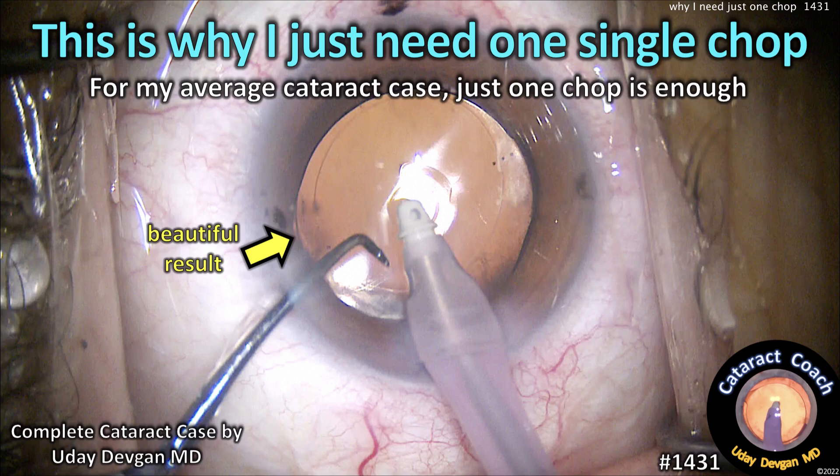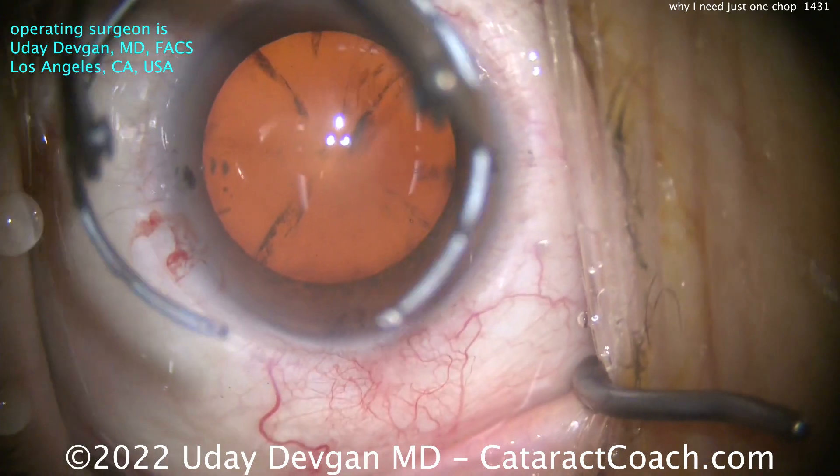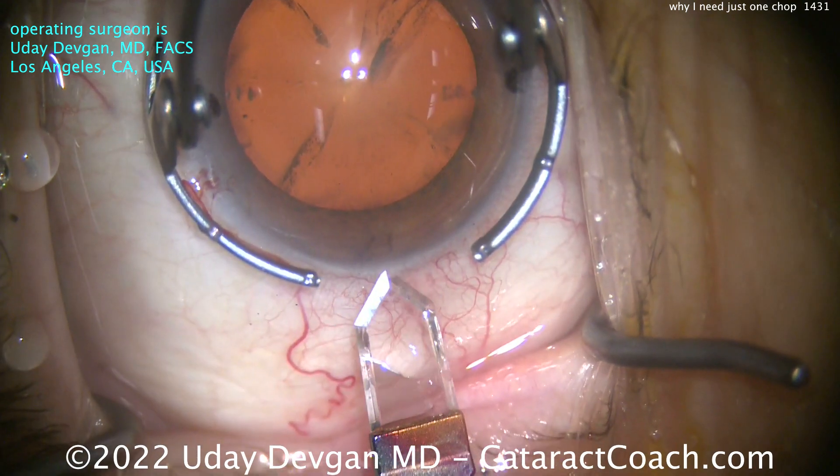CataractCoach.com. This is why I just need one single chop. For my average cataract case, just one chop is really enough. Let me show you the case.